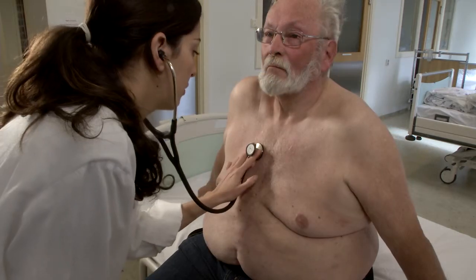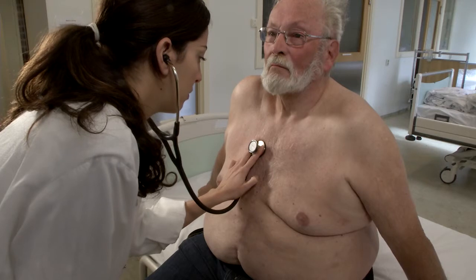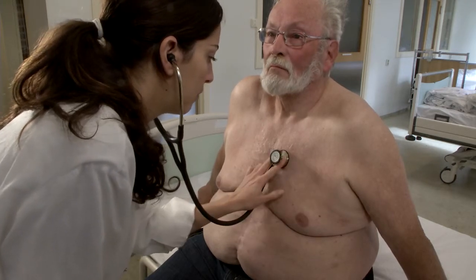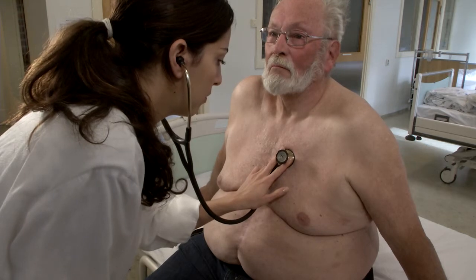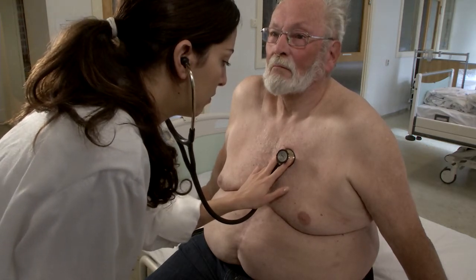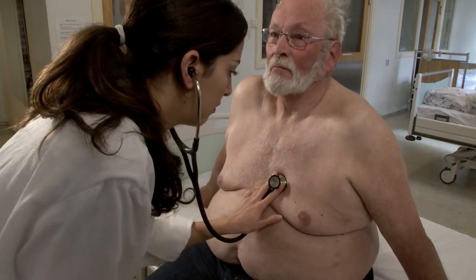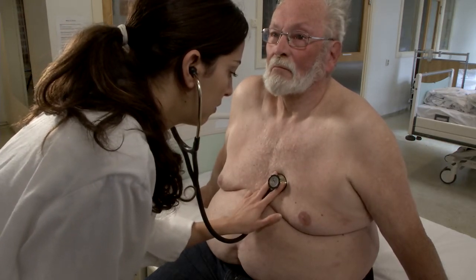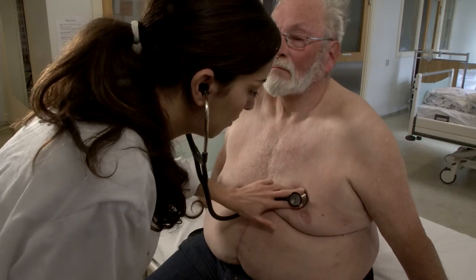Following the anatomical positions of the valves of the heart, systematically auscultate the heart in four locations: the aortic, pulmonic, tricuspid, and mitral. Using the diaphragm of the stethoscope, place it firmly over the second right intercostal space, then to the left second intercostal space over the pulmonic valve.